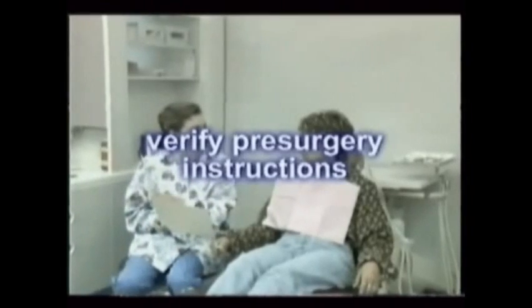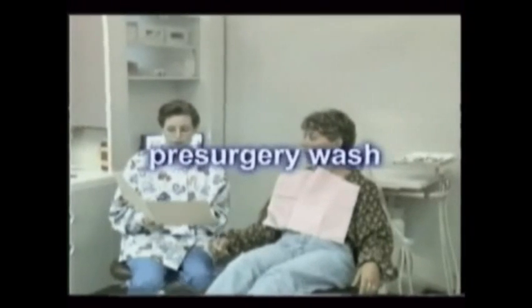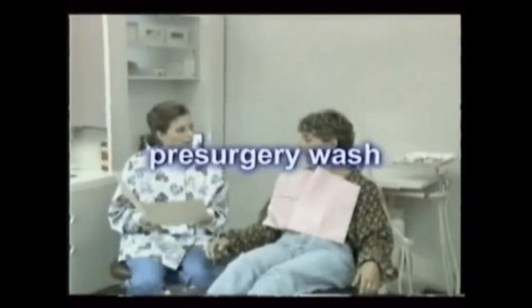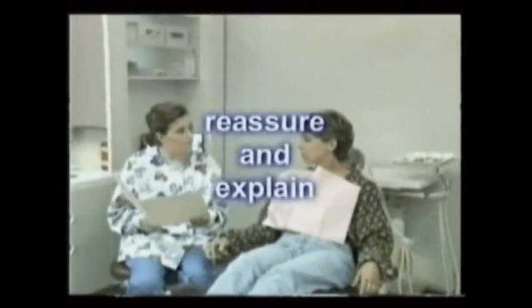This is a good time to verify that they haven't eaten anything as requested, and that they've used any necessary medicines beforehand. Finally, their health history is reviewed one more time. Some practices ask them to wash their face with surgical soap and rinse, and dry with a sterile towel or gauze. You can then elect to place a towel about their neck, reassure the patient, and briefly explain the procedure.